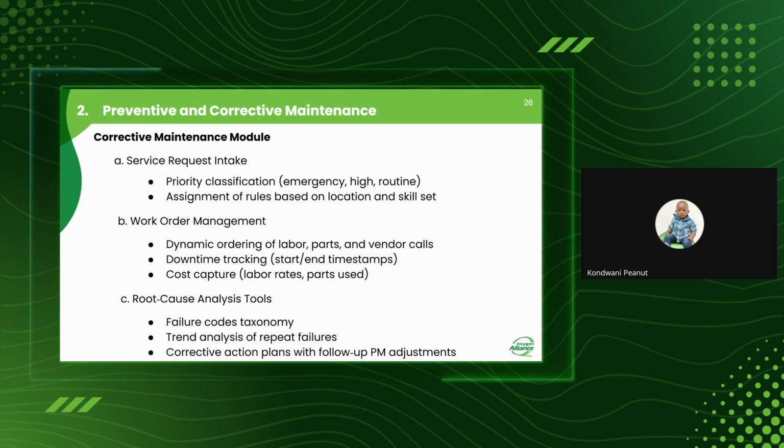So what we do in Balaka District Hospital, for example, in terms of management, we make sure that every equipment which is coming into the system, normally equipment comes through the Department of Pharmacy. We have an inventory at hand for a particular department or section, and any equipment coming from the pharmacy has to pass through the engineering department. Why? Because we need to put it in inventory, we need to provide the trainings, we need to test the machine, we need to calibrate the machine, and then we need to initiate what we call a health passport.